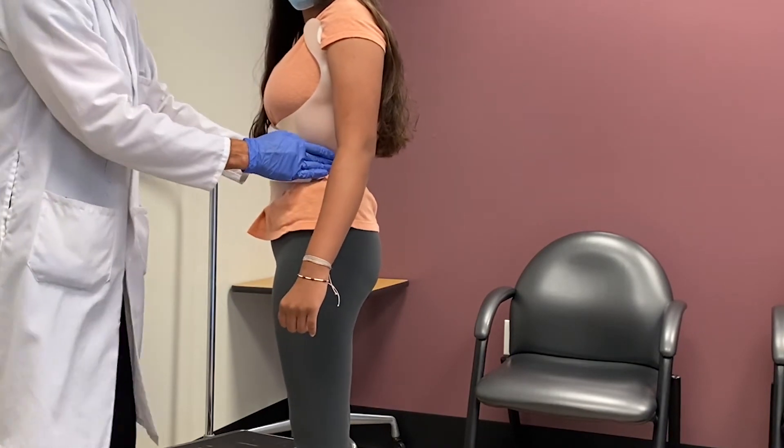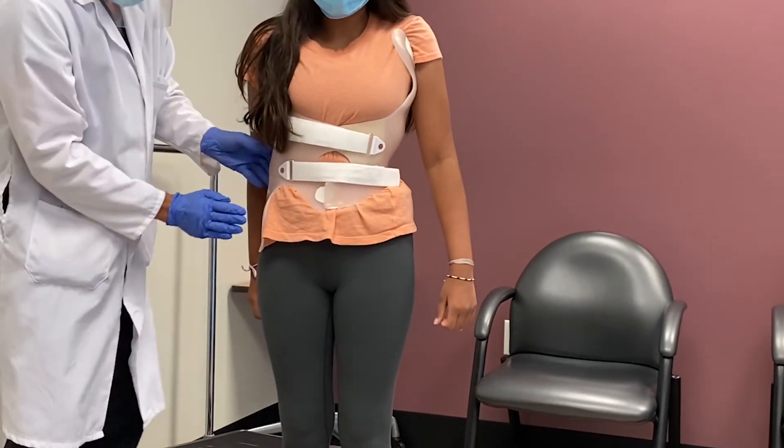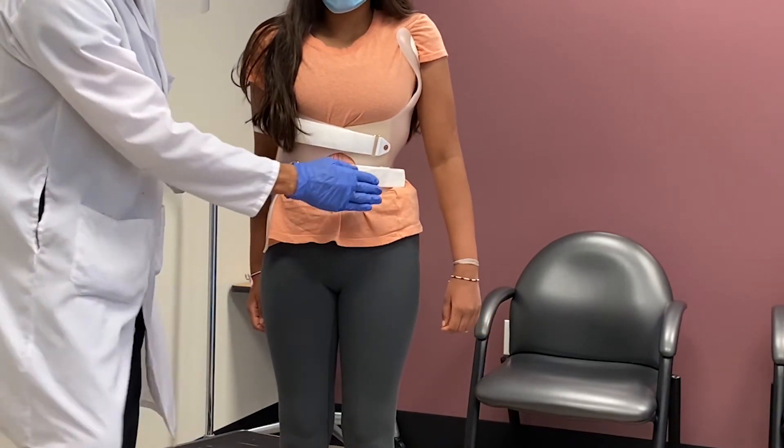Here we have a lumbar push that does not use a pad. On the opposite end you'll see the counterforce to the lumbar push.